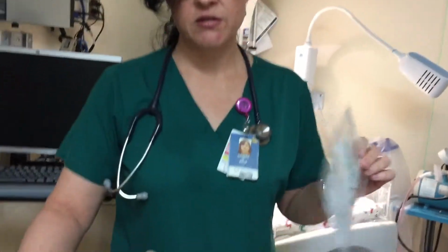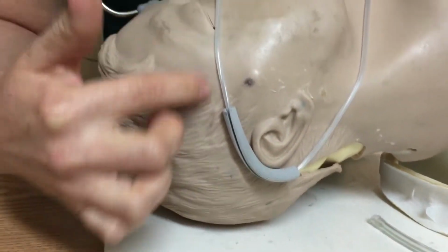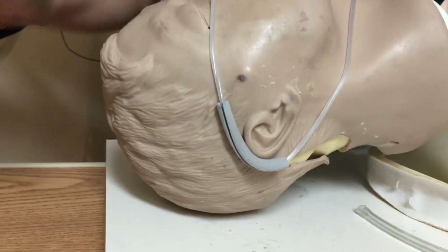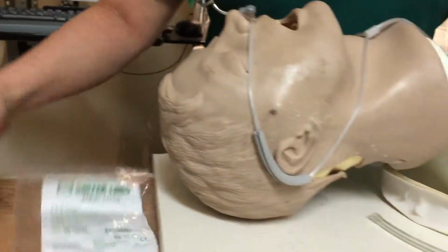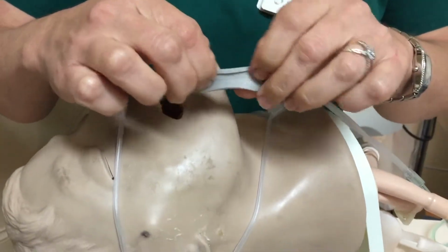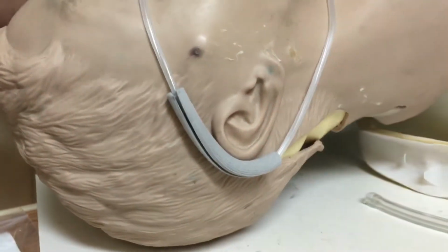Next, we're going to talk about protecting behind the ears with patients that are on nasal cannula. This also applies to the mask, to the elastic string of the mask. You'll find these on the cards. They're easy wraps. They're non-adhesive though, so it's a challenge to get them to stick on the patient, but they still protect just as well.